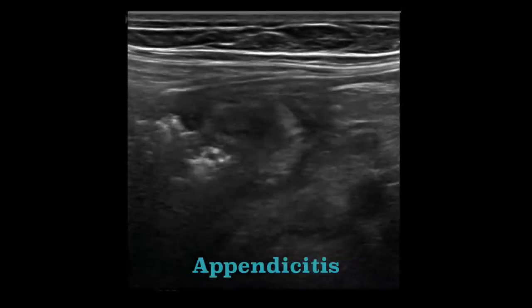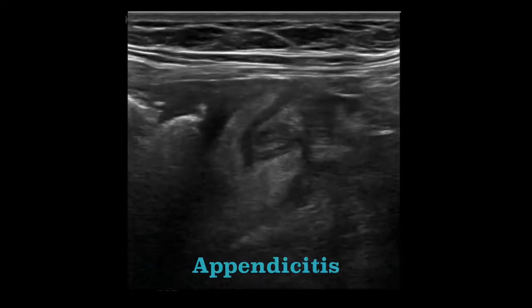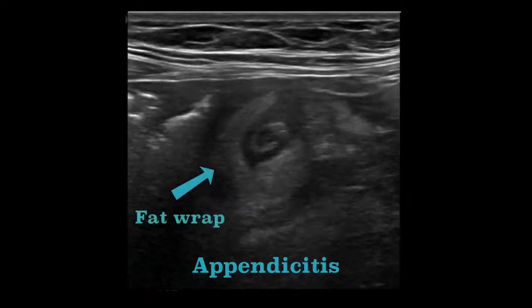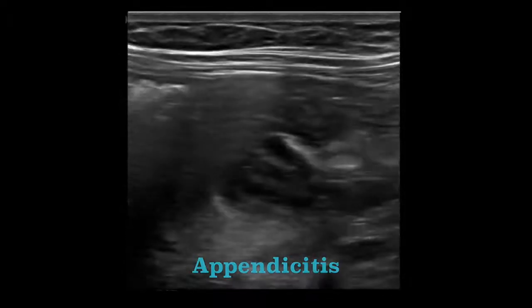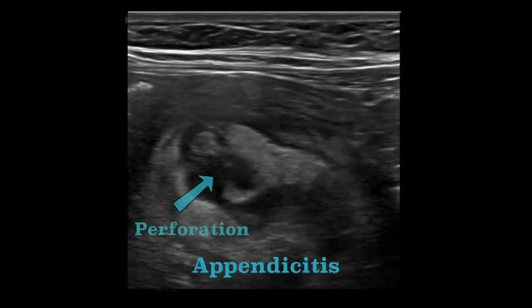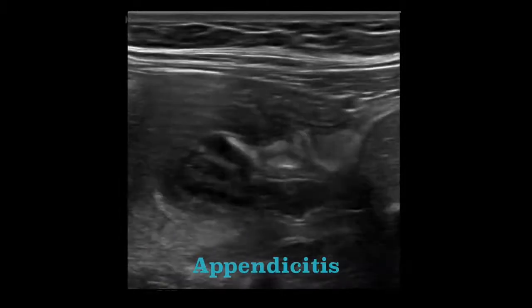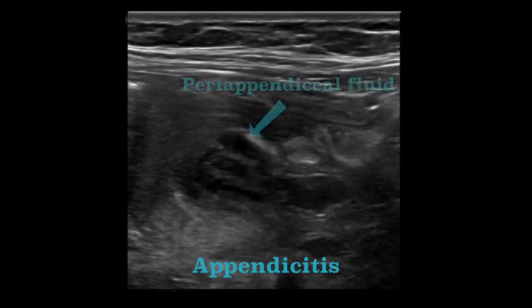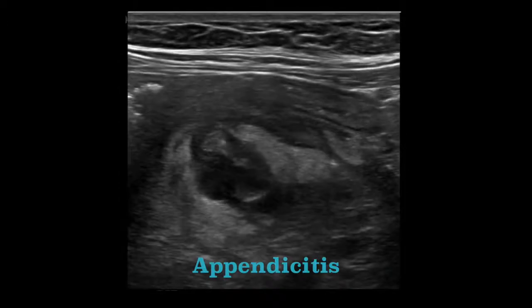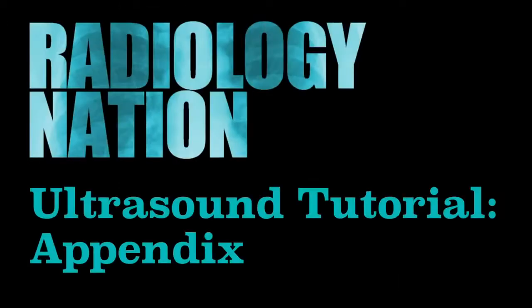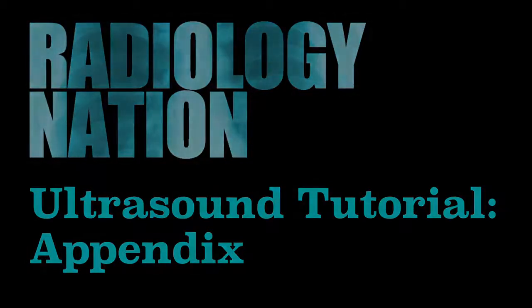Here's another example of appendicitis on ultrasound. Again, we have a dilated, thick-walled appendix. This time, there is a discernible fat wrap of inflammatory tissue. As we continue scanning, we see a defect in the wall of the appendix. There is also some surrounding peri-appendiceal fluid. These findings are suggestive of a perforated appendix. During the course of this video, I hope to have showed you a strategy for imaging the appendix with ultrasound. This is a difficult skill to acquire, but with practice, you can diagnose appendicitis effectively and without the radiation dose of CT.